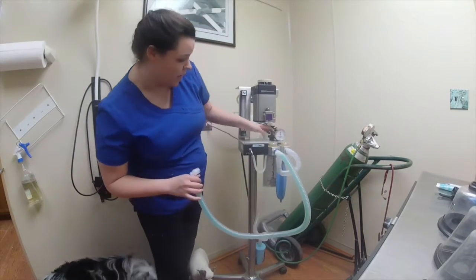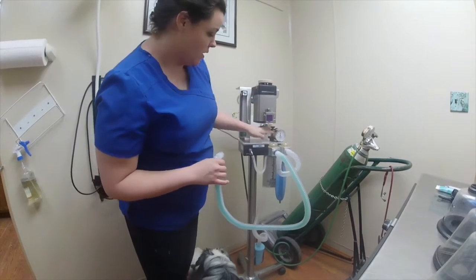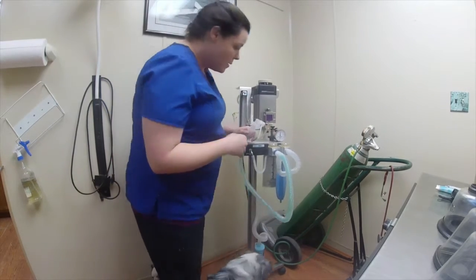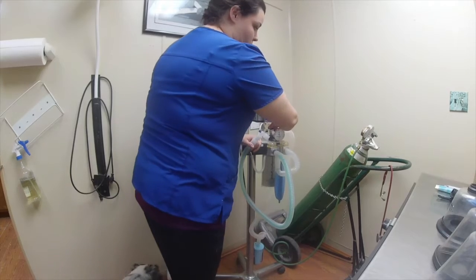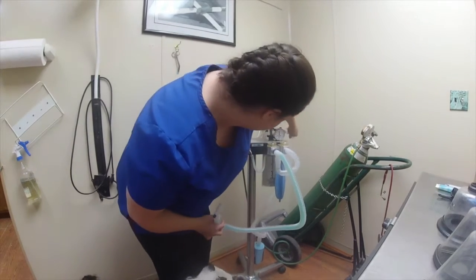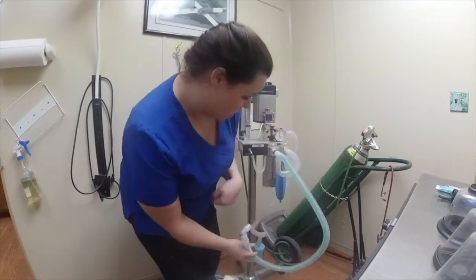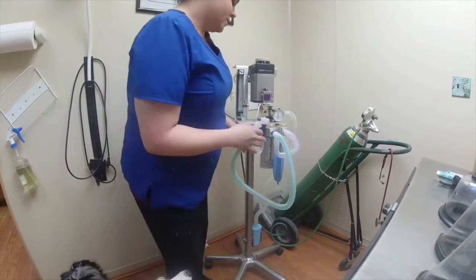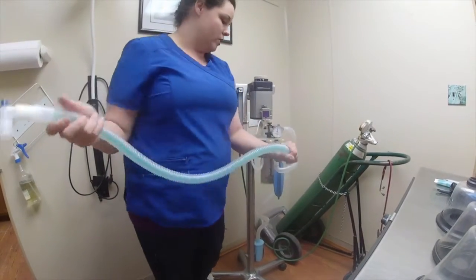We have the screw here that will undo the soda lime canister. Back here is our relief pressure valve, and it connects to our waste container, which is down here. And then we have our tubes.